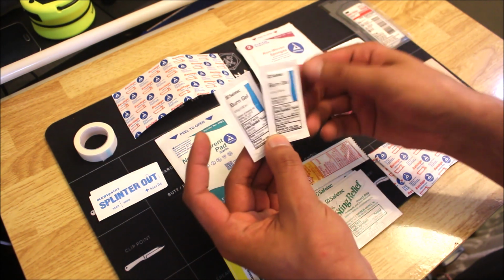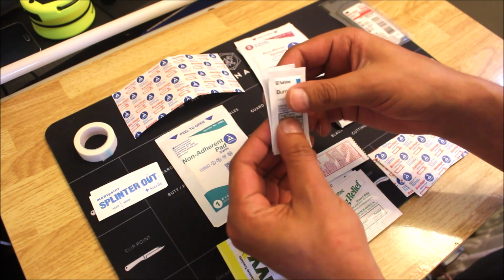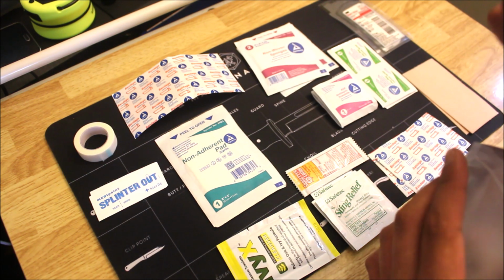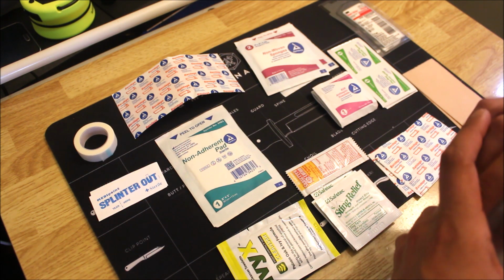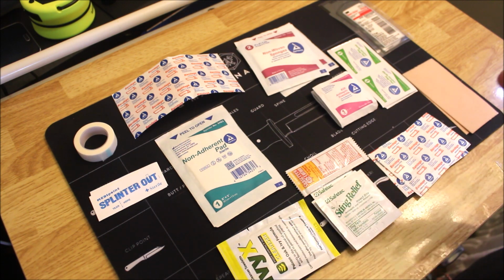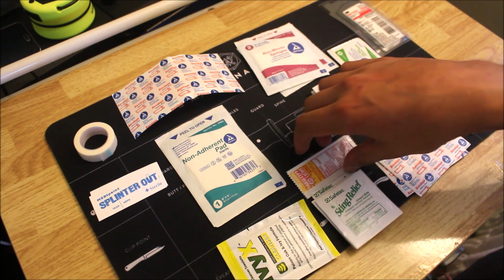Here we have 2 packs of burn gel. Yeah, I've burned myself a lot on just about everything. Cooking, cigarettes, of course, on fire pits and things like that. So that's definitely a good item to have to heal up a burn a little quicker.